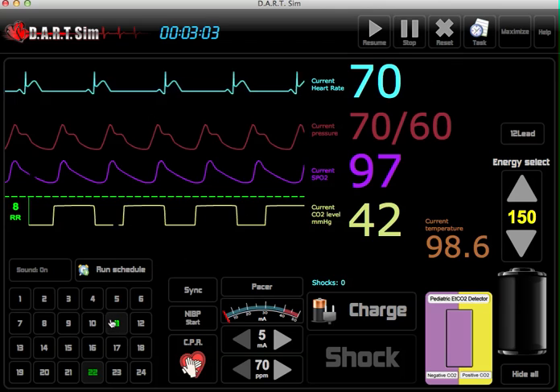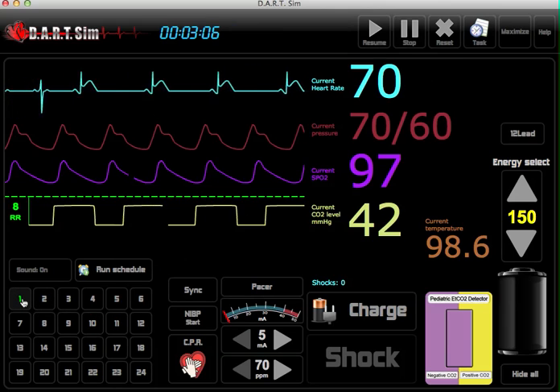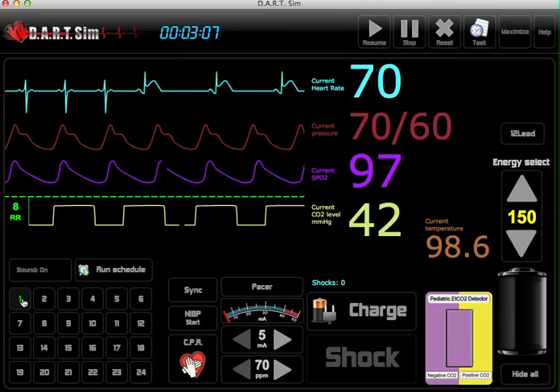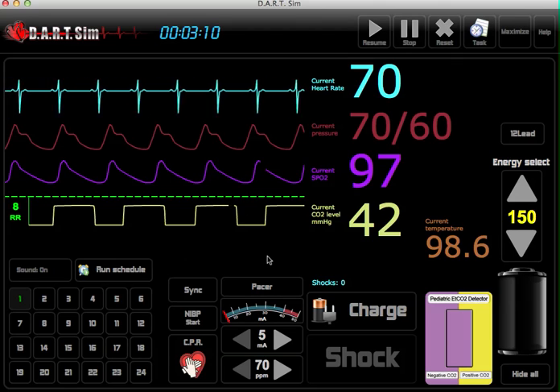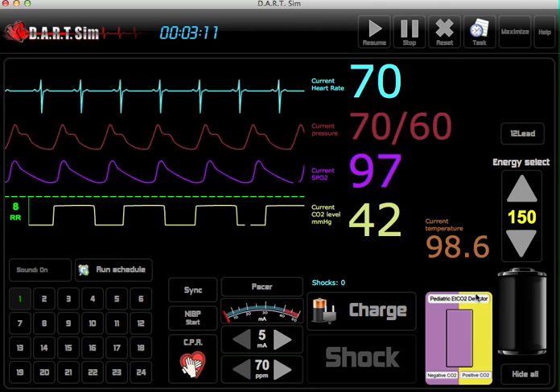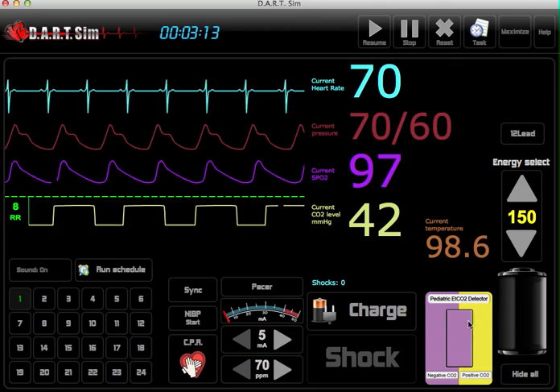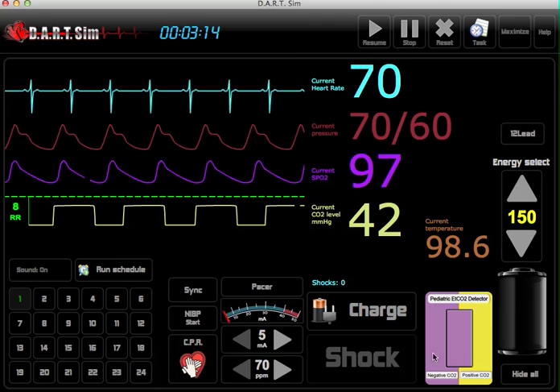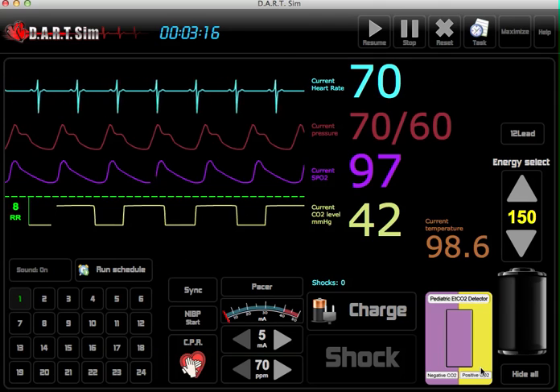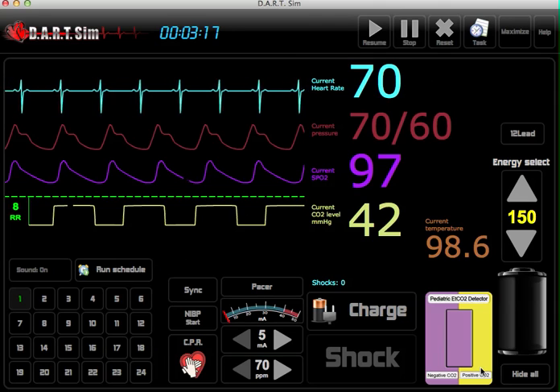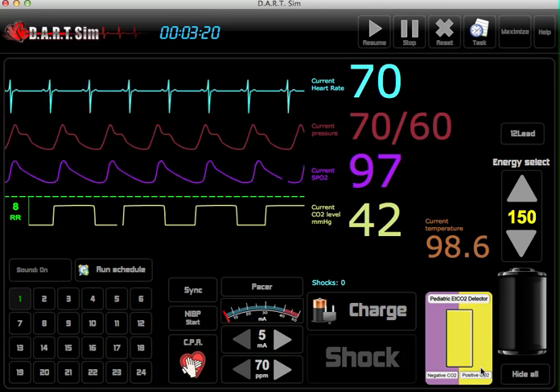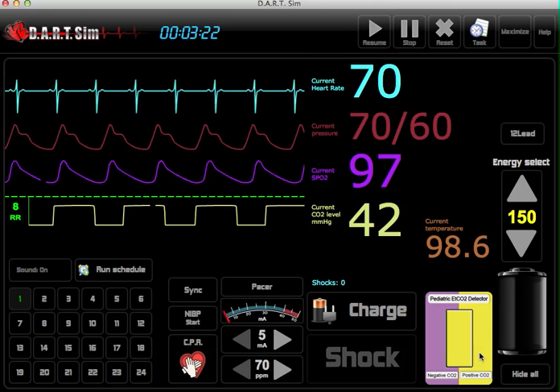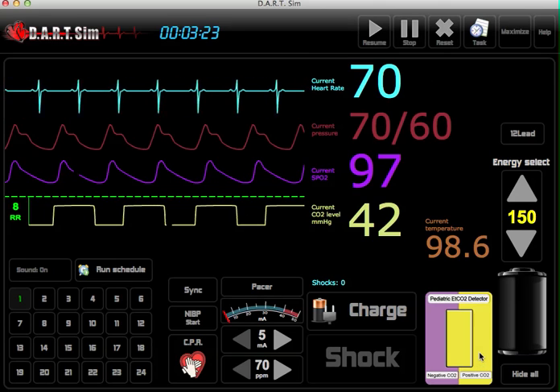For NRP courses, if capnography is not utilized, you can also use the pediatric end-tidal CO2 detector here by simply clicking on the detector to notify the student that they have a good tube.